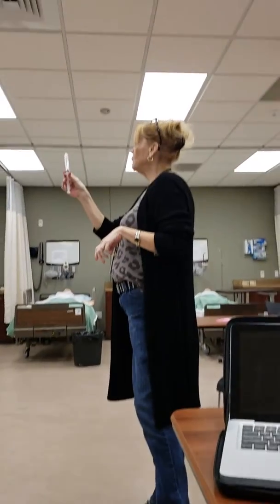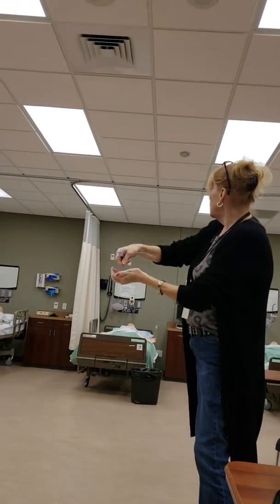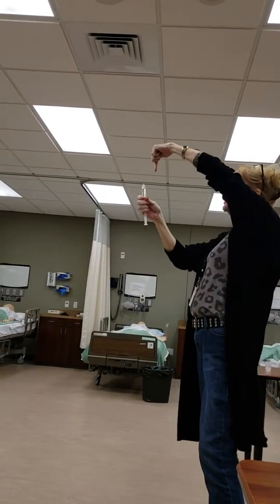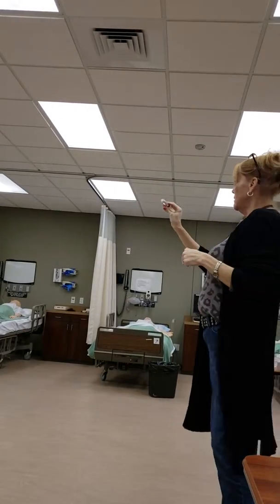You take your blunt needle, you draw up your Pepcid, you get your 2 mLs, you take your blunt needle and you put it in here, and now you're diluted. Okay? That's the easiest way to do it.